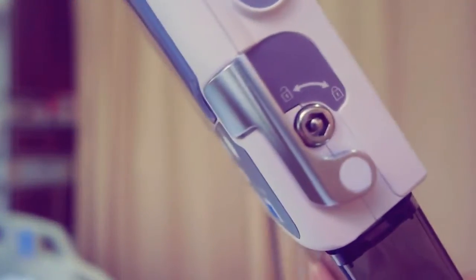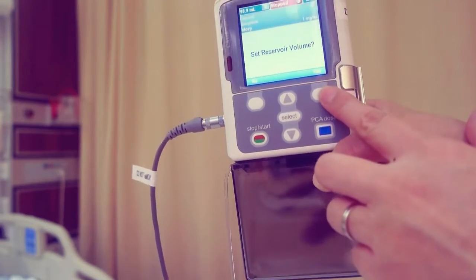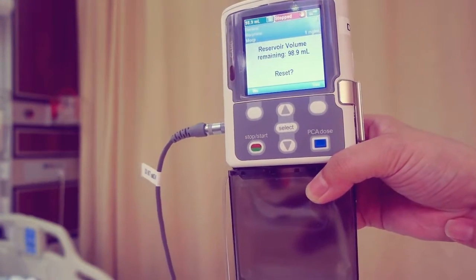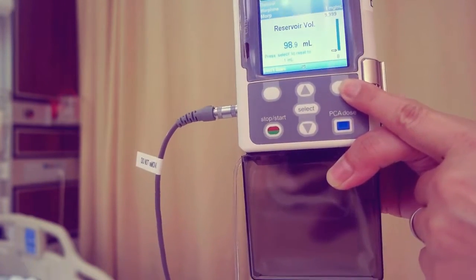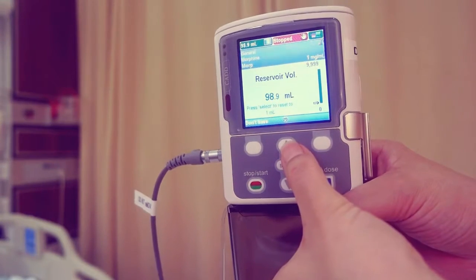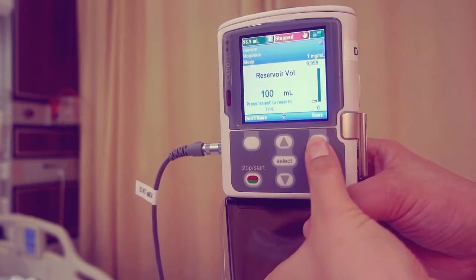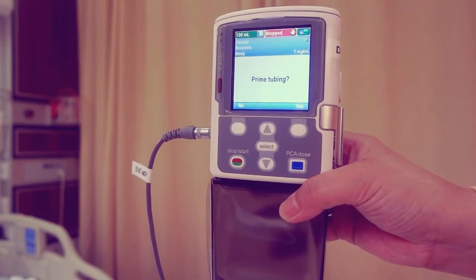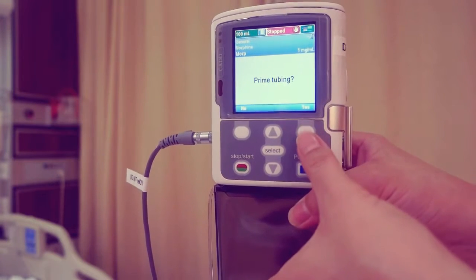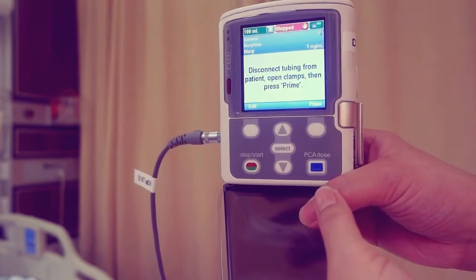After changing the cassette, set reservoir volume displays. Press yes. The screen displays the current reservoir volume and reset. Press yes. Scroll up or down to adjust the value and press save. Prime tubing displays. Press yes. Then press the prime key.